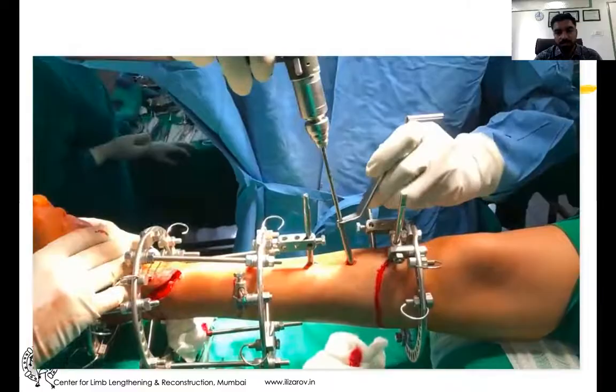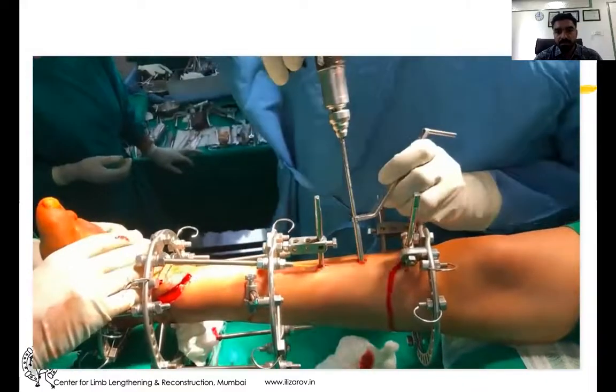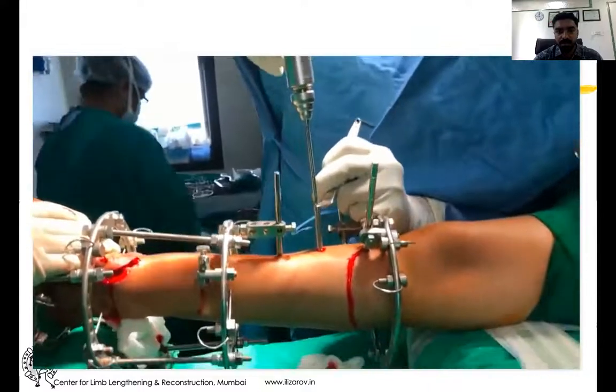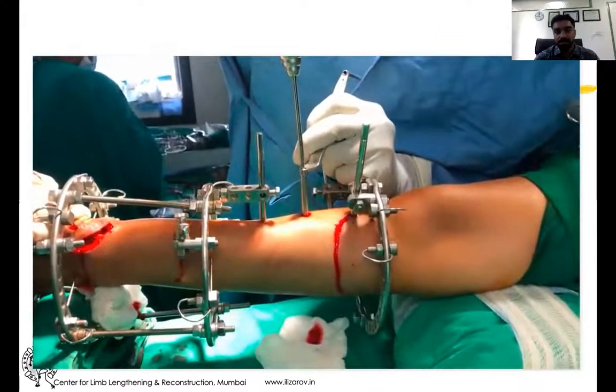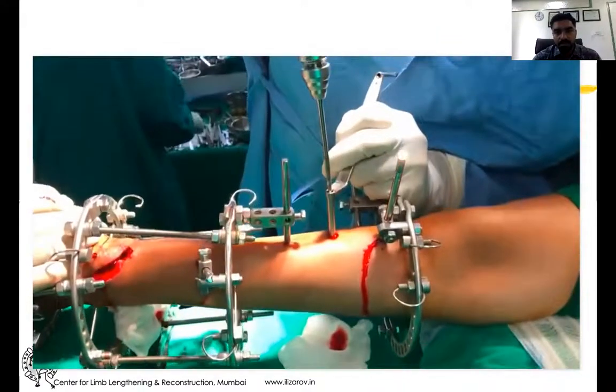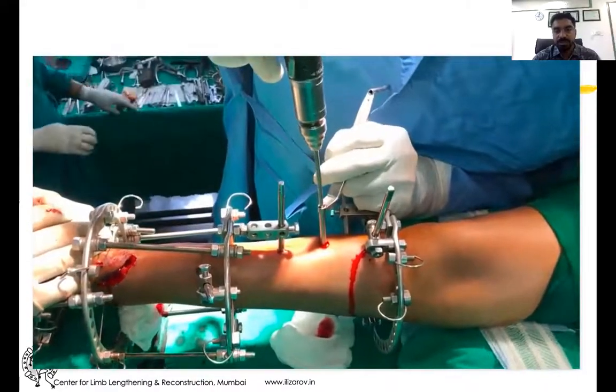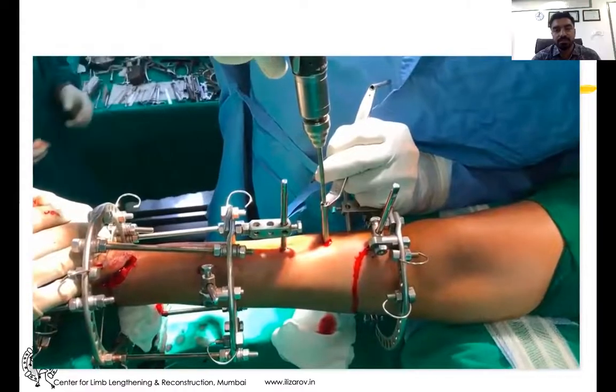Then you use a drill sleeve with a 4.5 to 4.8 millimeter sharp drill bit — a sharp drill bit is a must. You can appreciate the antero-posterior drilling through the incision along the elevated periosteum side.